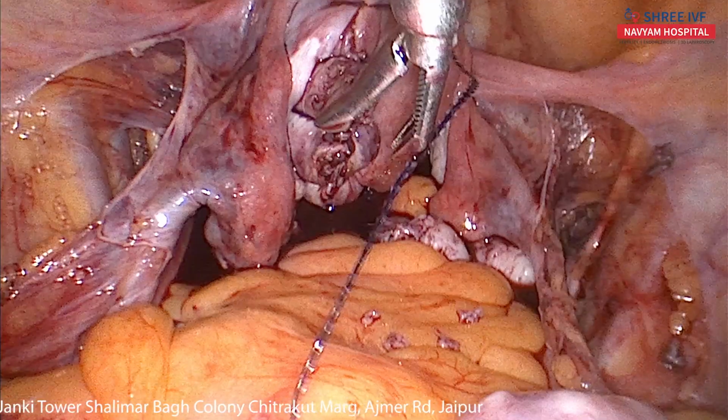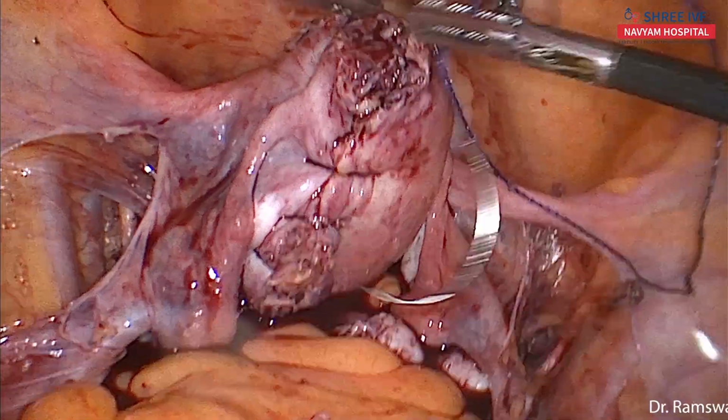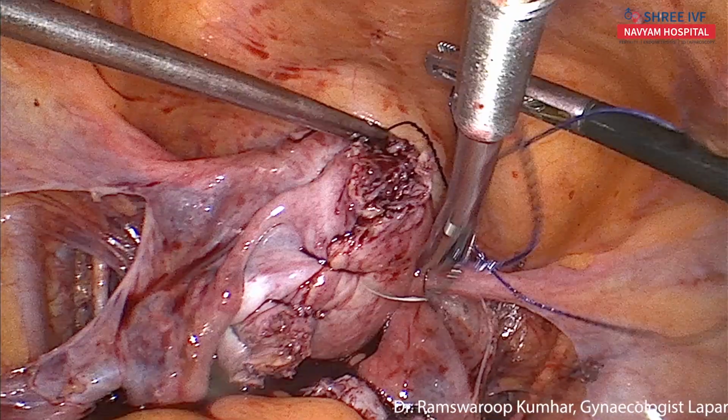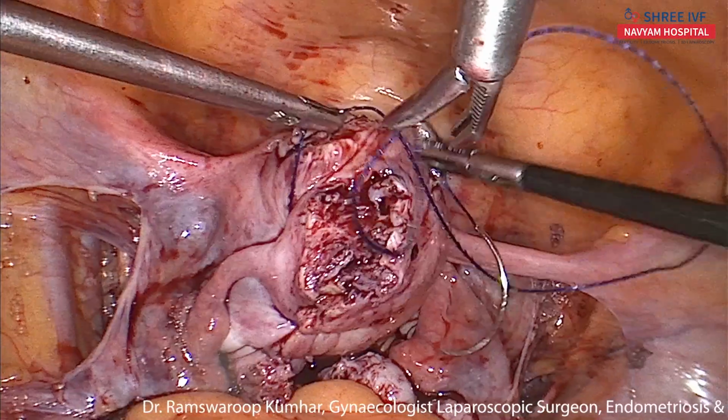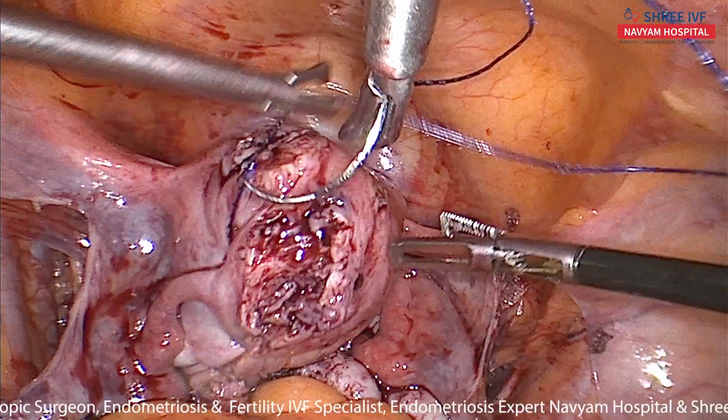This tube is gone because the fibroid was very deep on this side, anterior as well as posterior on this left side. Okay.